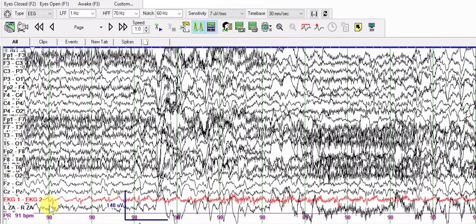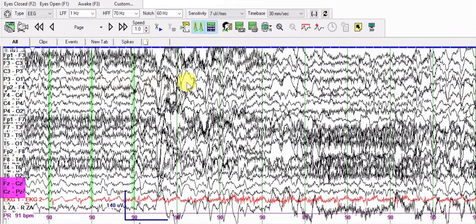Good morning. Let's read an EEG and interpret it step by step. When you look at an EEG it looks like a mess — there's a lot of overlap in the channels. For newcomers: channels ending with an odd number record from the left side of the brain, channels ending with an even number record from the right side, the red channel is the ECG recording, and channels ending with the letter Z record from the midline. These green lines are separated by one second.